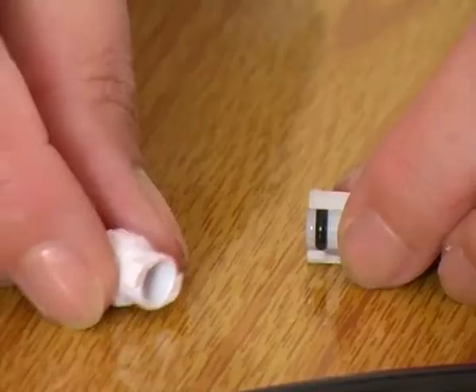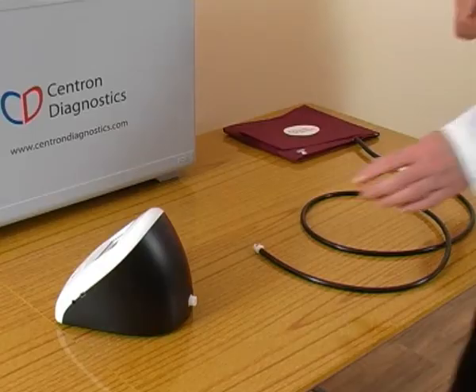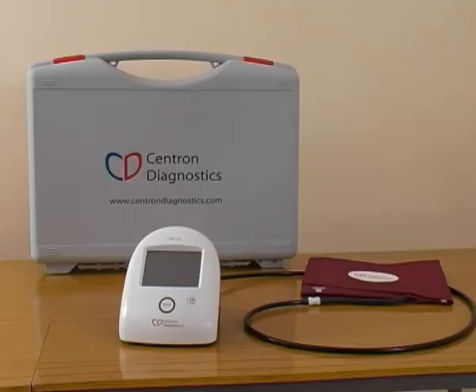Now connect the cuff to the hose and then connect the hose to the connector at the rear of the instrument. You are now ready to use the instrument in the same way as a standard automatic monitor.